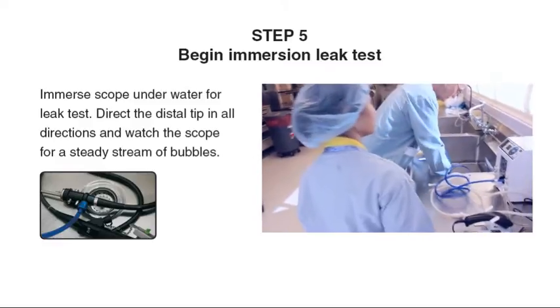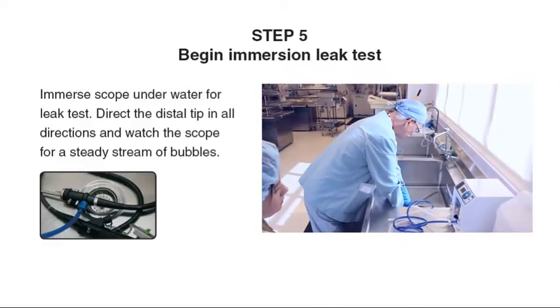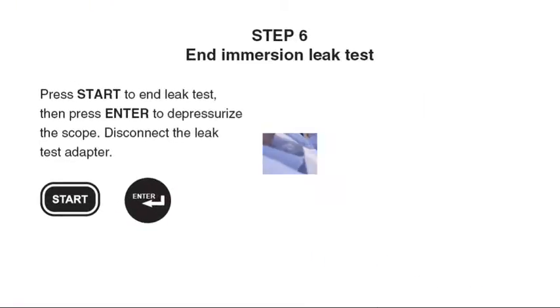Step 5: Immerse the scope under water for the leak test. Direct the distal tip in all directions and watch the scope for a steady stream of bubbles. If a leak is detected, follow the scope manufacturer's instructions for further processing.